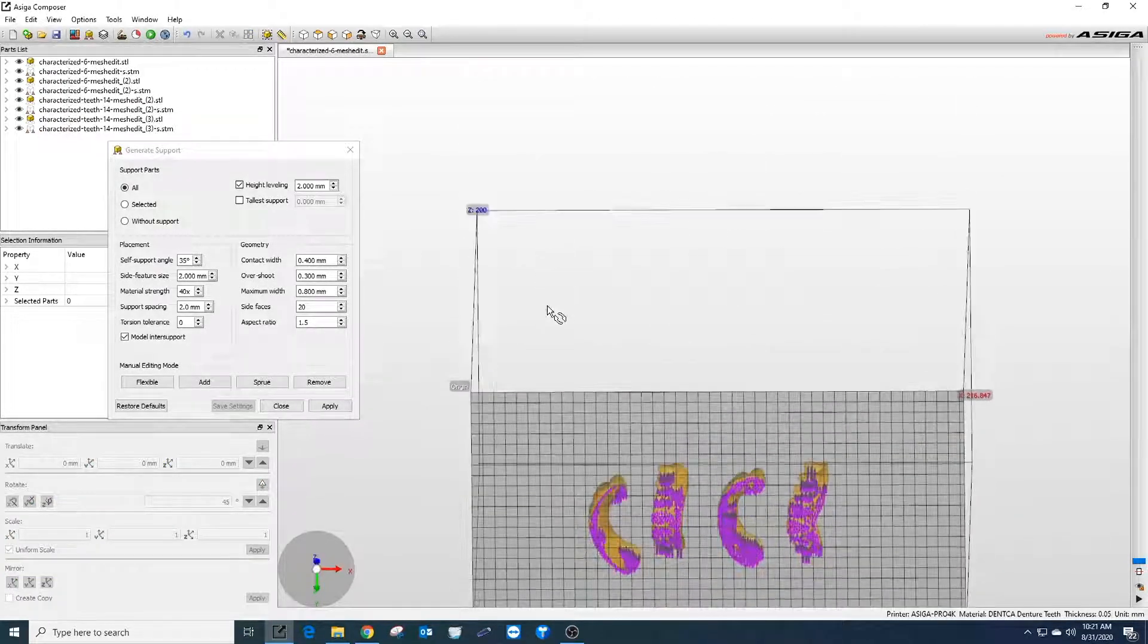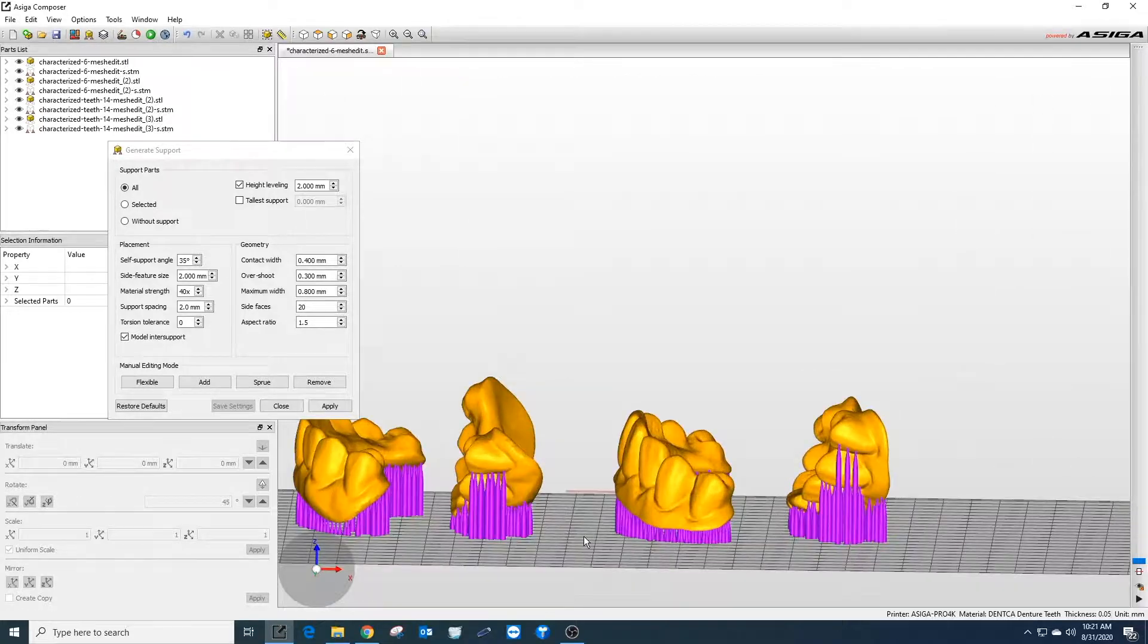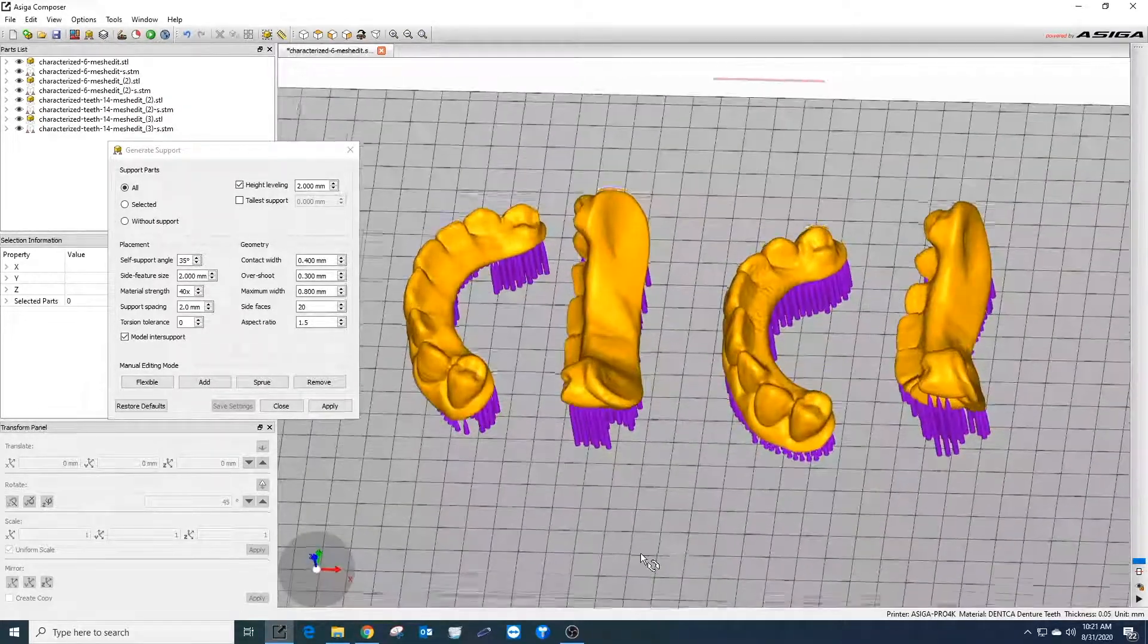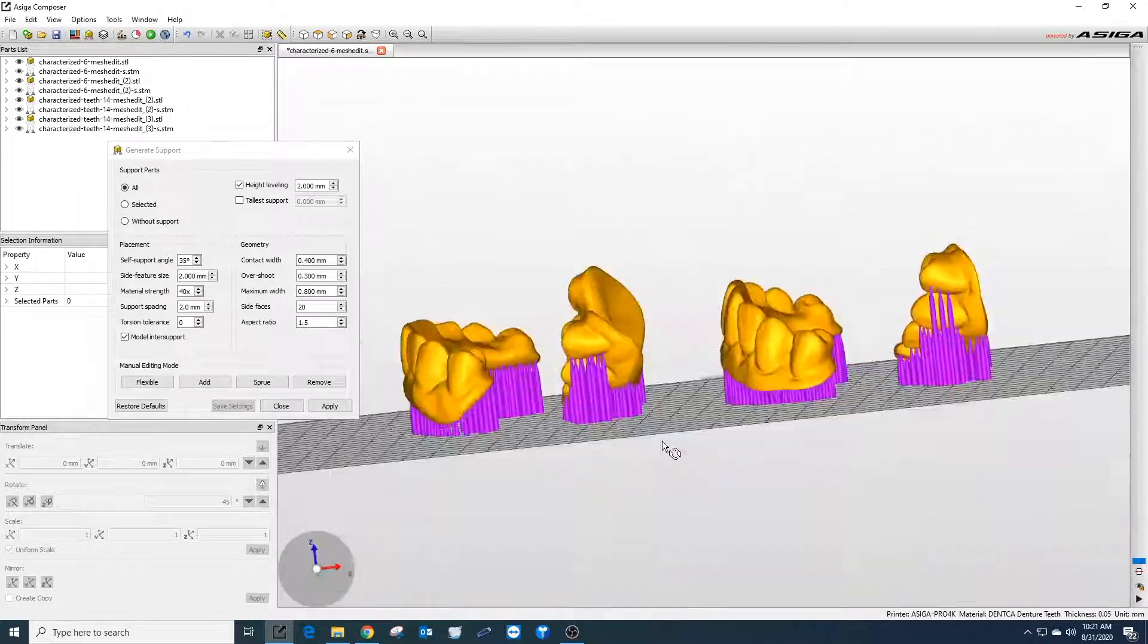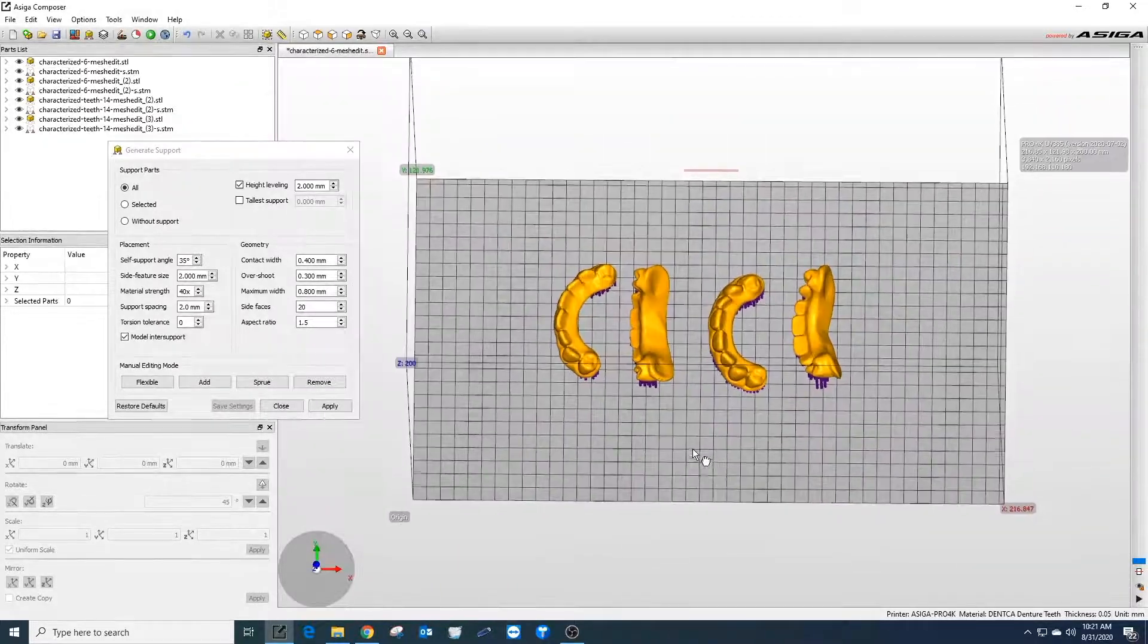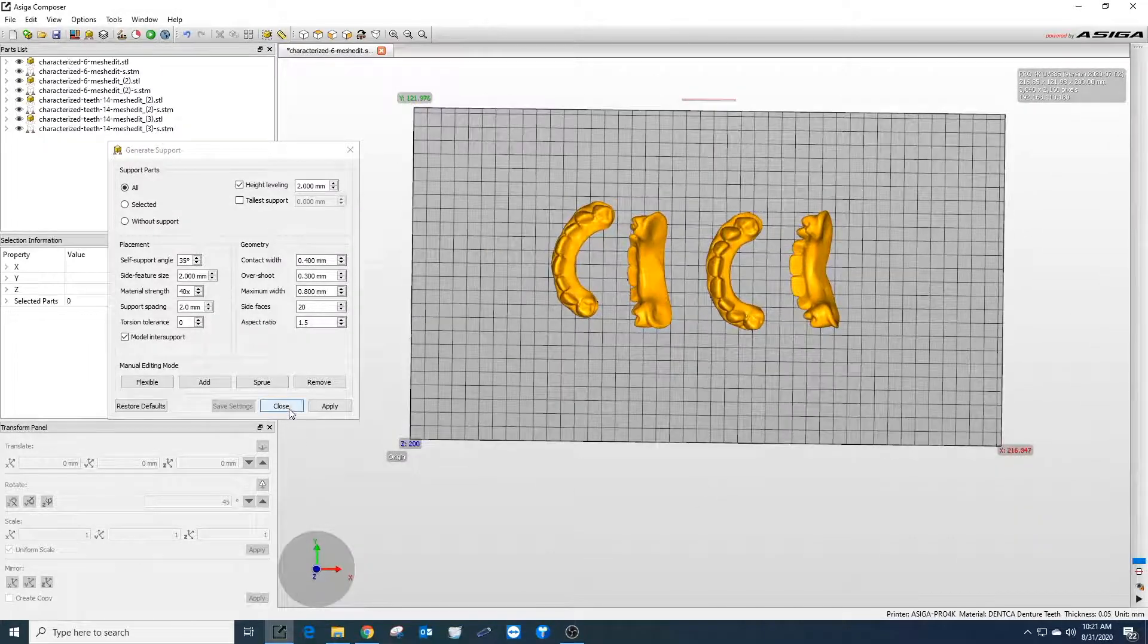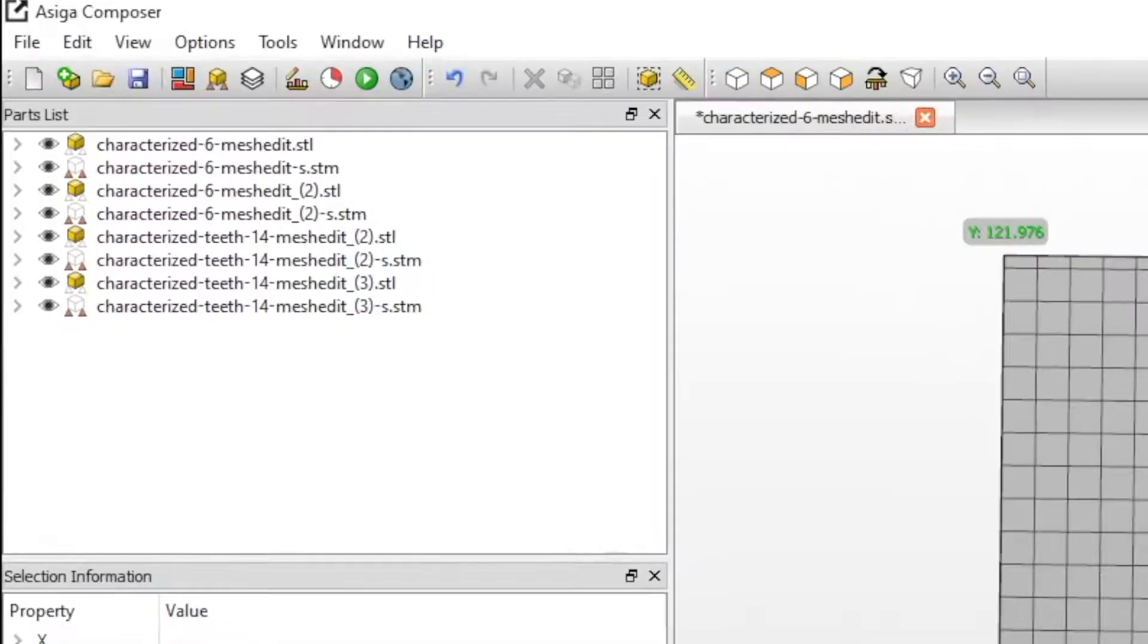Because the supports are very small, this allows for little scarring to be left behind when removing supports from the build. Check all sides of the build to ensure the whole print job is inside the dimensions of the build area. After ensuring the print job is ready, the next step is to submit the job to the printer.